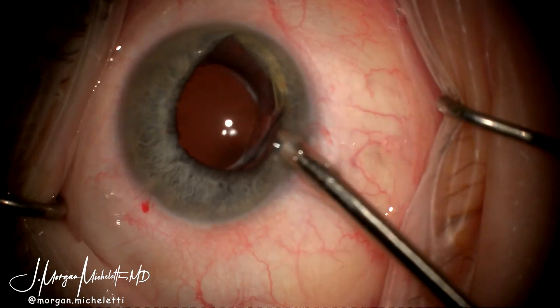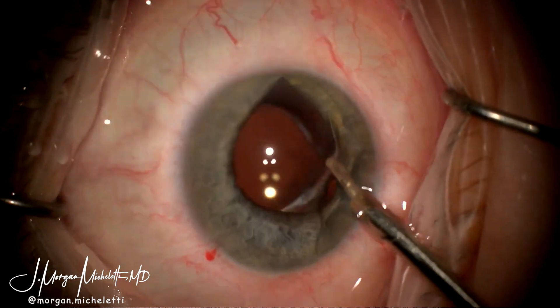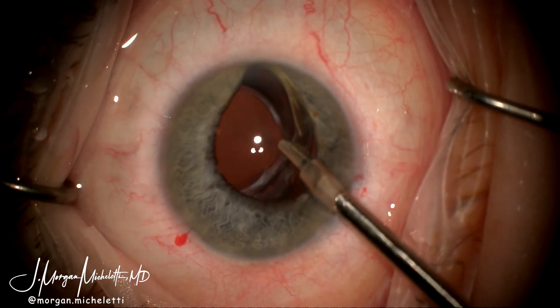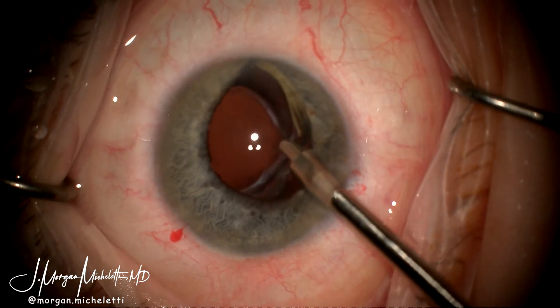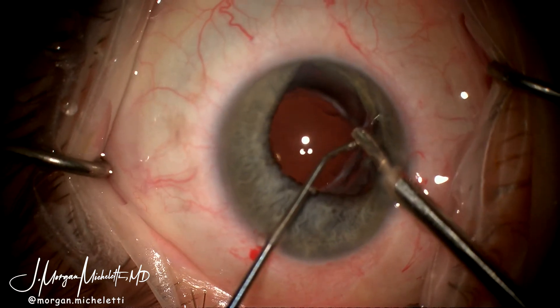The zonules are intact superiorly and suture fixation is only necessary on one side of the IOL-bag complex. As this is a single-piece lens, the Yamani technique would not be useful and the Canabrava technique is only applicable to a secondarily placed single-piece IOL.